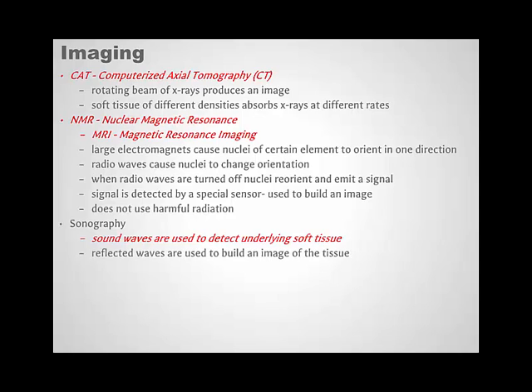Basically, it works like sonar in a sub or what a bat uses, by sending out sound waves. Now they're beyond the human range of hearing, but they are sound waves, and then listening for them to come back. And by interpreting those returning sounds, an image is formed.